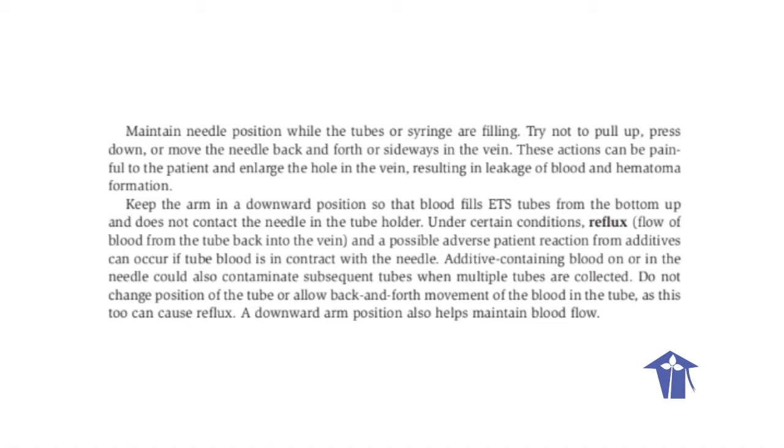Under certain conditions, reflux, which is flow of blood from the tube back into the vein, and a possible adverse patient reaction from additives can occur if tube blood is in contact with the needle. Additive-containing blood on or in the needle could also contaminate subsequent tubes when multiple tubes are collected. Do not change position of the tube or allow back and forth movement of blood in the tube, as this too can cause reflux. A downward arm position also helps maintain blood flow.